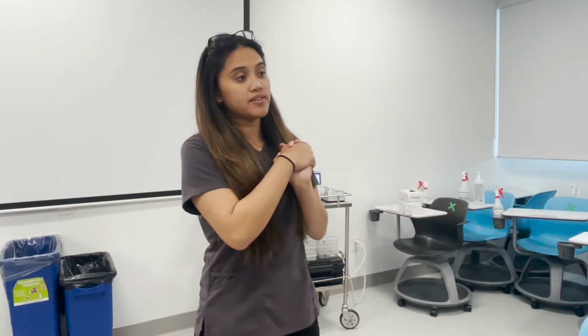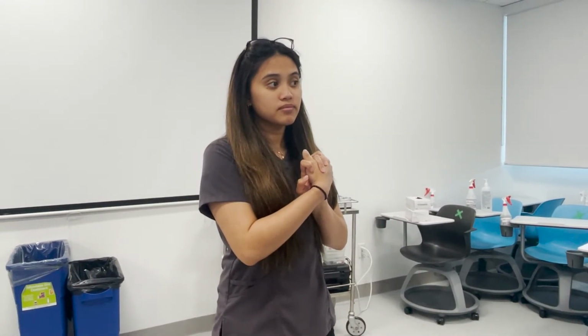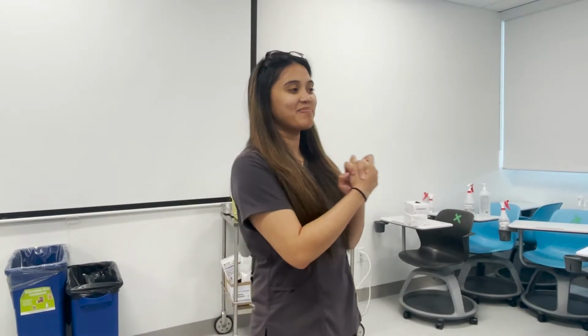And then how about you? Can you tell me what happens if it's below 4? Drink 2 cups of juice. Yes, that's right. Perfect. So just remember 4 to 7, those are our golden numbers. And even if you have a good reading, make sure to take your other medications so that it stays good. Sound good? All right, thanks, Mary.